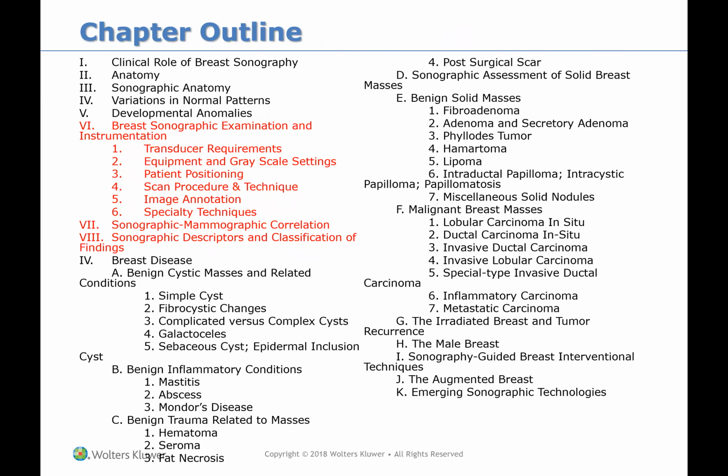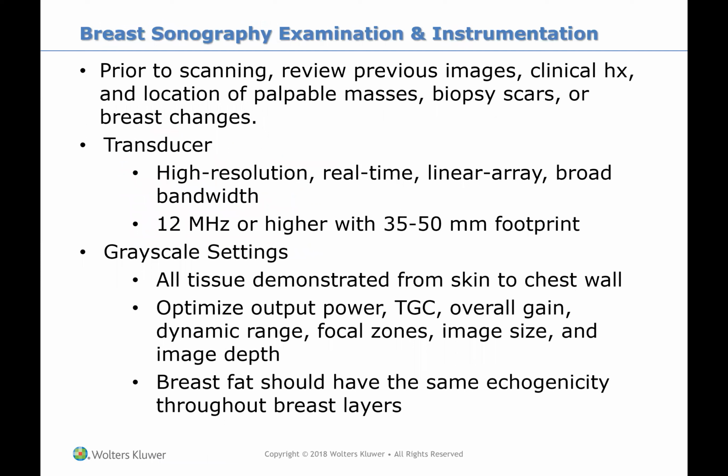We'll go over this really quick and then we'll be done. So prior to scanning, it's so important, just like anything else, but even more important in breast, I think, because you've got to really know where you're looking. You review previous images, clinical history, location of palpable mass, biopsy scars, or breast changes.